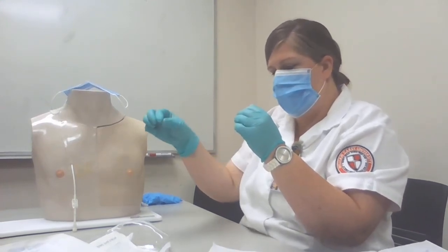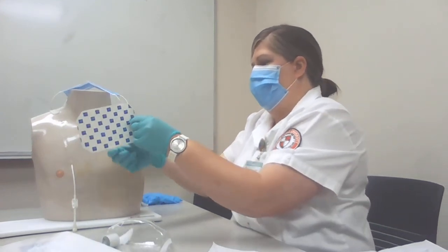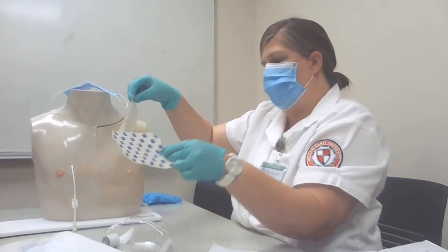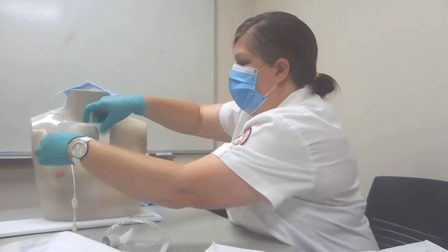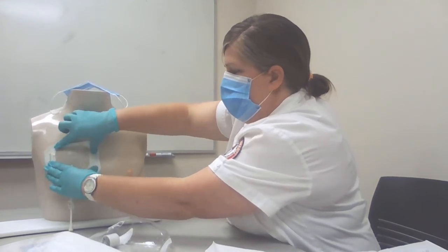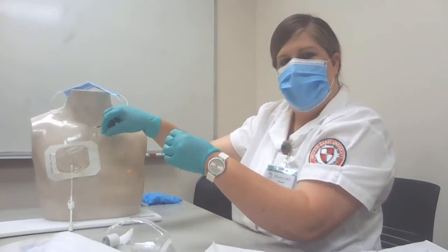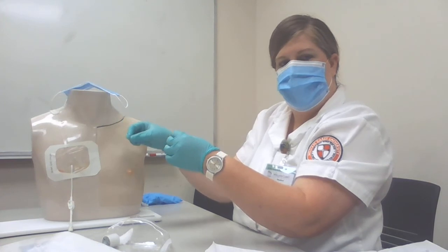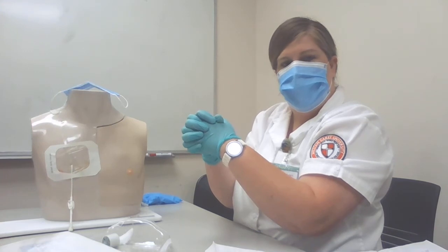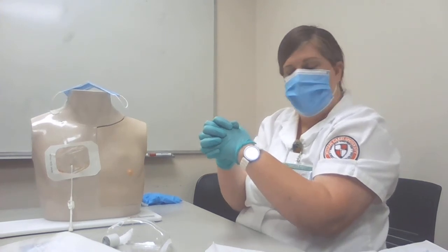Okay, next I'm going to get the new dressing, remove the backing and apply it over the site, and make sure I secure it down. I would date, time and initial the dressing so the next shift would know when it was last changed. Usually it is changed every 7 days, or according to the policy, or if it's soiled or anything.